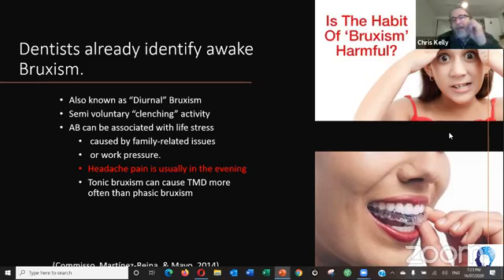But that number's bound to be revised as methods of measuring bruxism become more obtainable, beyond the lab-type test and more into the type 2 studies, and to a lesser extent limited channel bruxism studies or screenings like the Bruxoff, which detect different types of bruxism: awake bruxism, sleep bruxism, idiopathic, pain-related and psychosocial bruxism. They're for the level 1 study if you want to go the whole gamut.